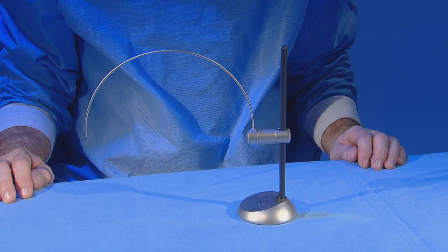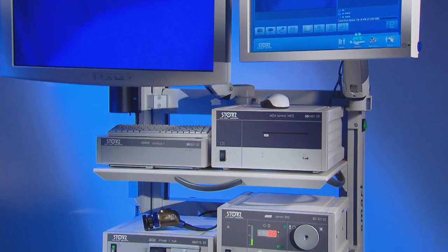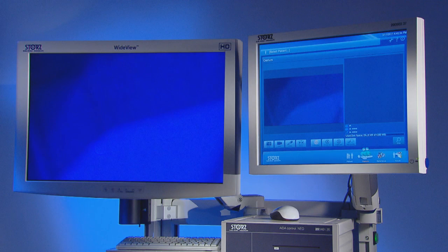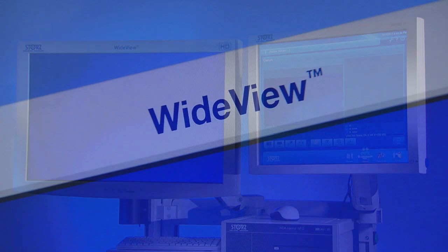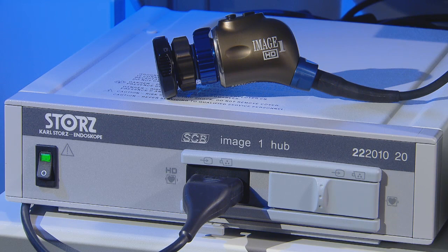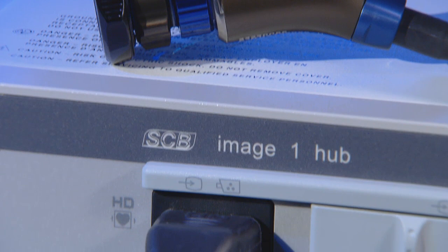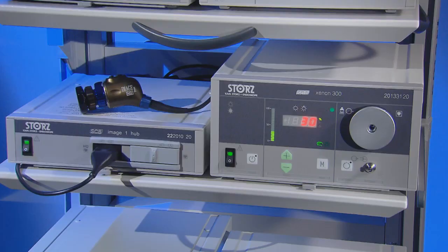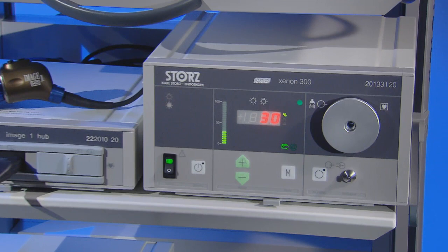All the hardware required for the operation and documentation is integrated in a video tower. High-definition monitors reproduce an image precisely and thus facilitate the procedure. The Image One HD camera head transmits images in full HD with a resolution of 1920 by 1080 pixels to the Image One HD camera control unit. With the xenon light source, the light intensity can be adjusted to provide the desired result.